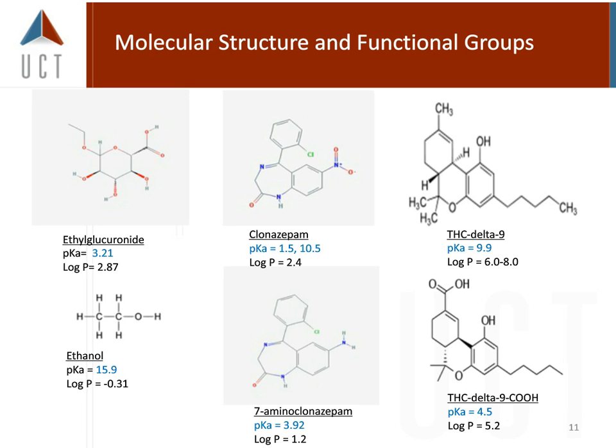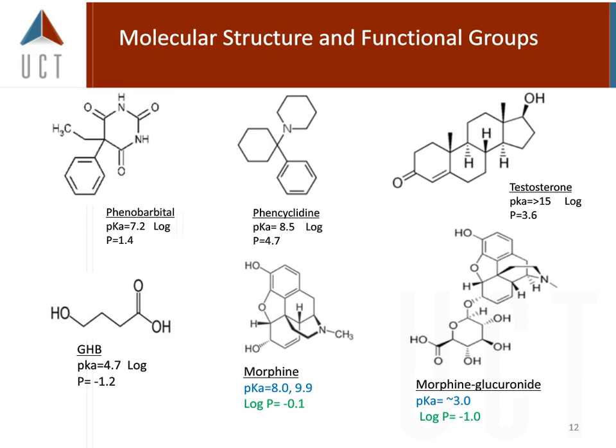So with respect to that, you need to understand that every group of drugs that might be, for example, benzodiazepines, which is a large group of parent drugs and metabolites, may not all extract and or chromatograph the same way. And I'll show you some slides in a moment.